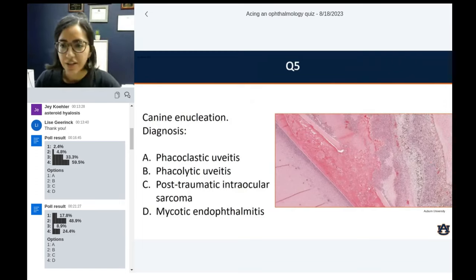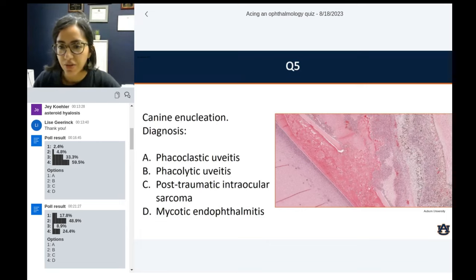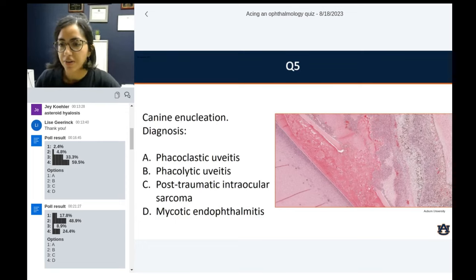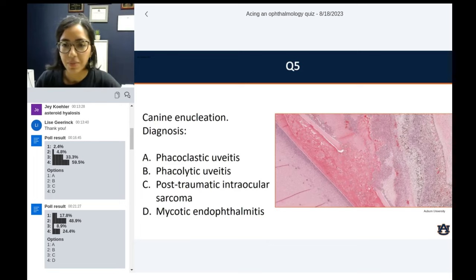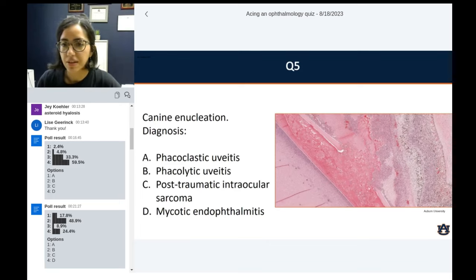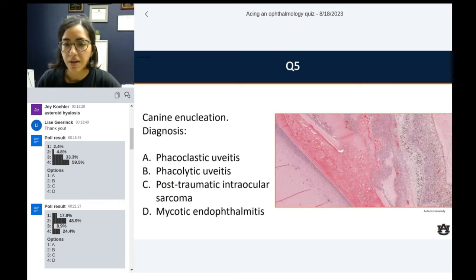Question number five: canine enucleation diagnosis. What can you already diagnose based on this picture? Is this phacoclastic uveitis, phacolytic uveitis, post-traumatic intraocular sarcoma, or mycotic endophthalmitis? Give me your best guess.